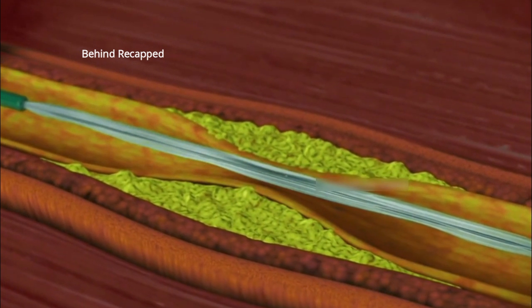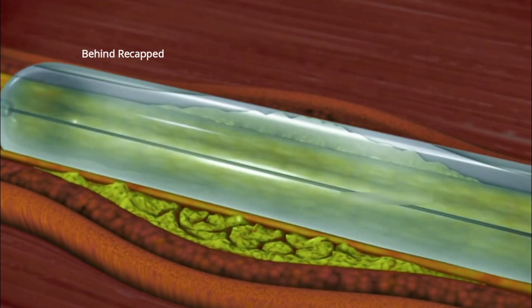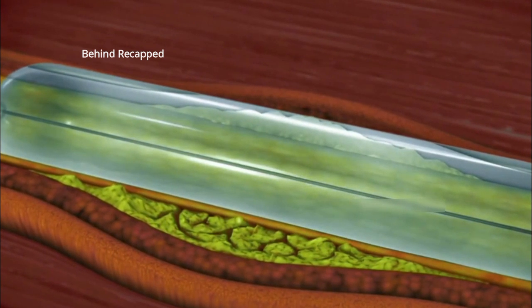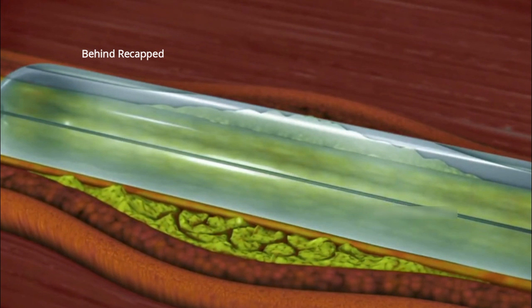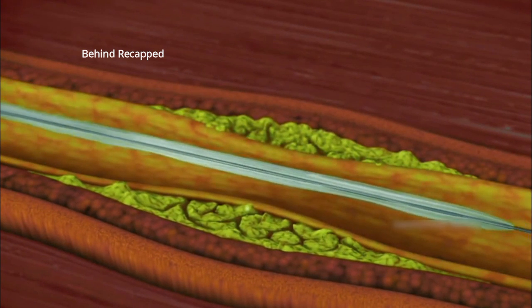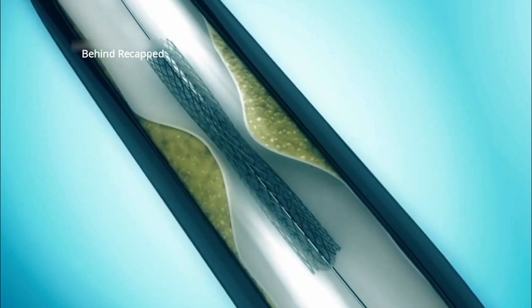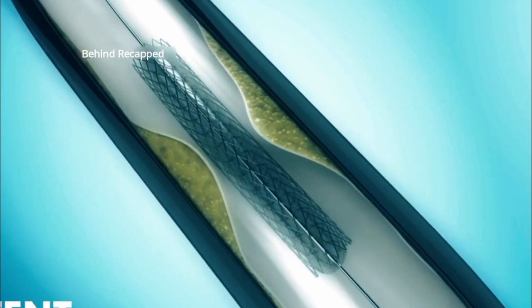After they locate the blockages, the doctor inserts a second catheter and a guide wire, usually with a balloon at the tip. While the second catheter is in position, the doctor inflates the balloon, by which the fatty deposits, or plaque, get pushed against the wall of the artery. This clears the way for blood flow.